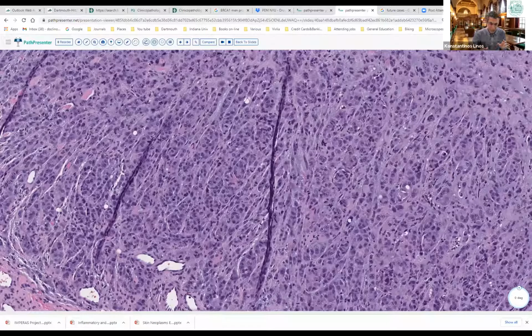What I'm trying to tell you is that you start very low with very few stains, relatively lineage specific stains. I wouldn't jump to a neuroendocrine marker immediately, because it may not be necessary at all when you get your initial screening panel. So you want to eliminate carcinoma, in quotes, because obviously many sarcomas are keratin positive. Your S100 or SOX10 for melanomas, which can look like anything. Your desmin. Just do a very, very brief panel, and then you can build off that panel.